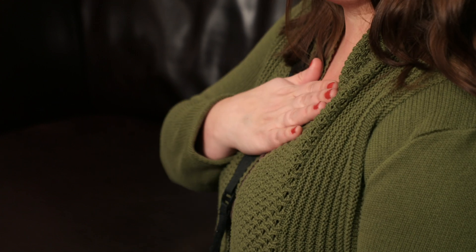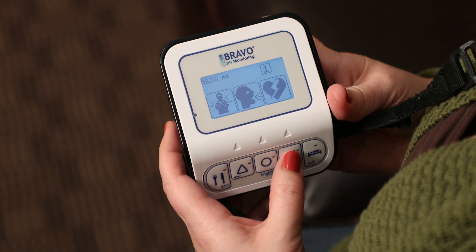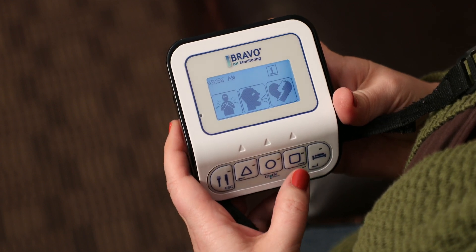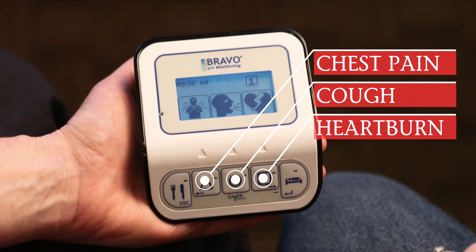When you are experiencing your typical symptoms, press the specific symptom button. Only press it one time and do not press it again until you experience that symptom again. Your nurse will discuss this with you.